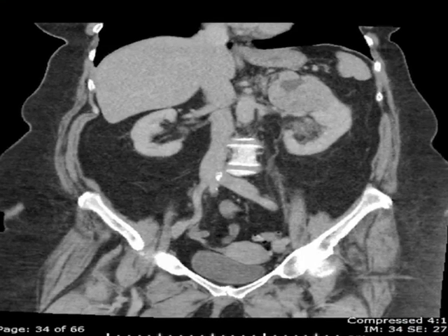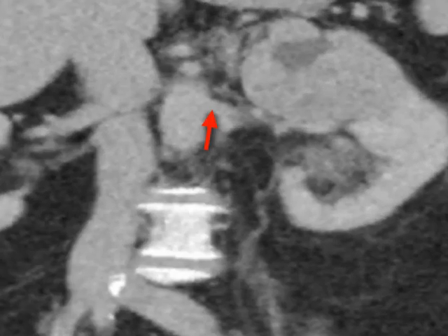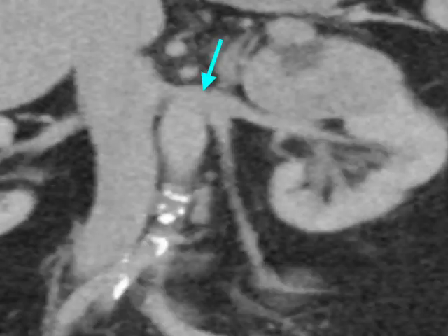As we scroll, we can also see the left renal artery as well as the left renal vein, which drains into the inferior vena cava.